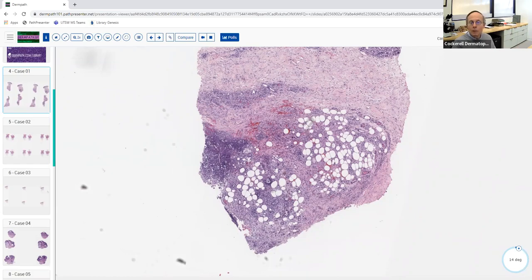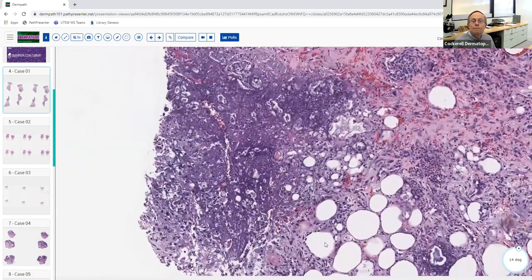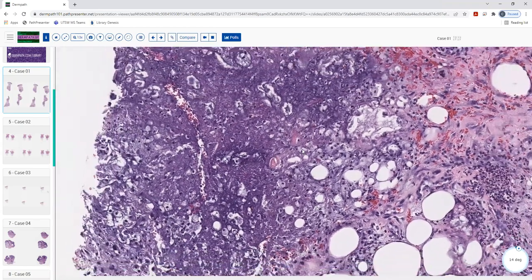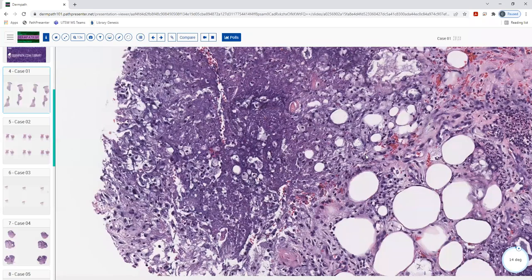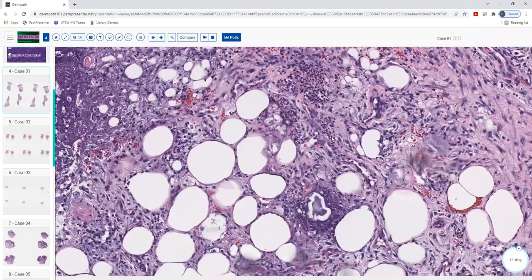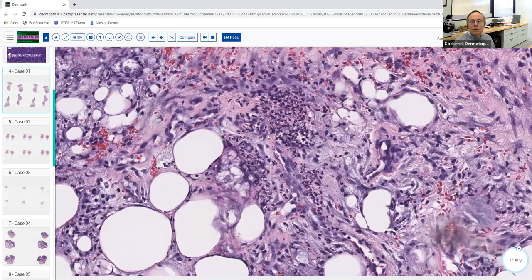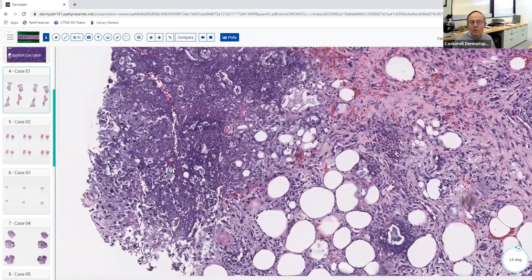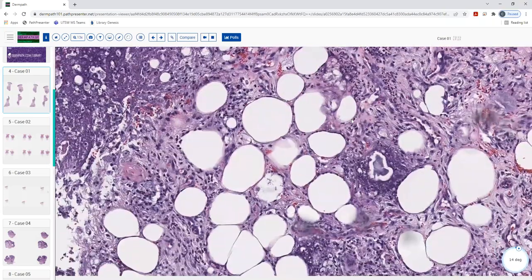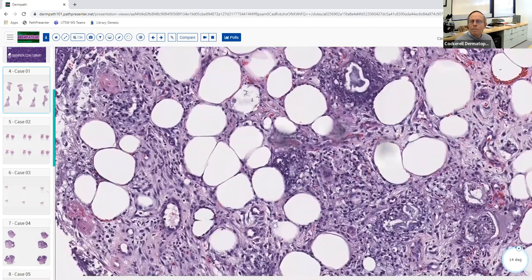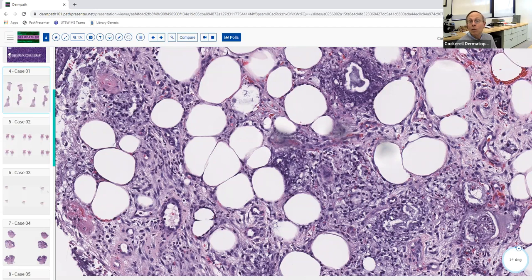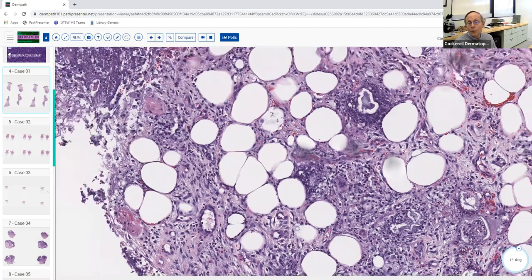Then you look for the type of inflammation — which you're exactly right about. What kind of cells did you see here? When I looked I saw some lymphocytes and some foamy histiocytes. And I thought I may have seen a couple of neutrophils too. So it's kind of a mixed infiltrate, but there are a lot of neutrophils. What cells were not present here? I didn't see plasma cells. Yeah, and eosinophils either — definitely not eosinophils. That's kind of helpful because in some panniculitides like erythema nodosum you can sometimes get eosinophils. Subcutaneous morphea can give you eosinophils, or a very deep arthropod assault reaction. So you definitely don't see eosinophils here.